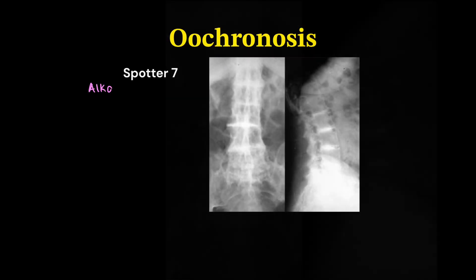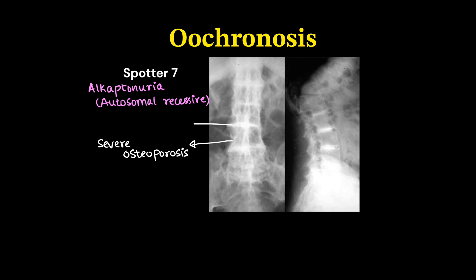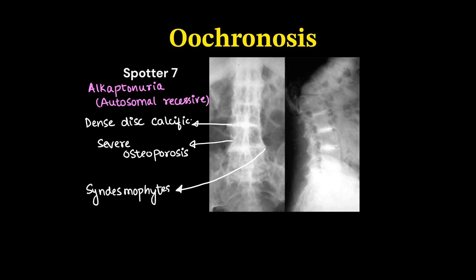This is a case of alkaptonuria, which is an autosomal recessive condition. We can see severe osteopenia of the vertebral bodies and dense disc calcifications between the vertebral bodies. There can also be syndesmophytes or bridging osteophytes, and disc narrowing will be present.